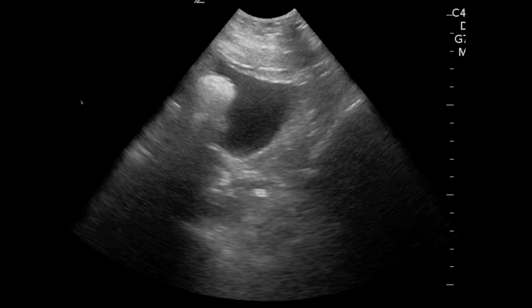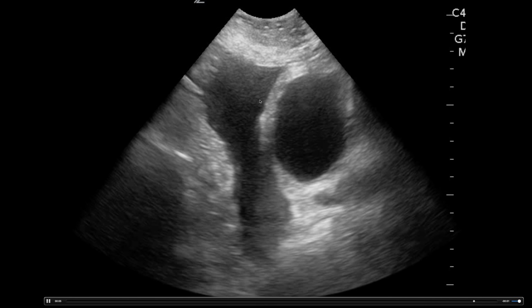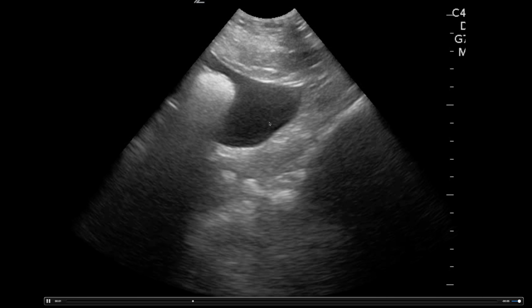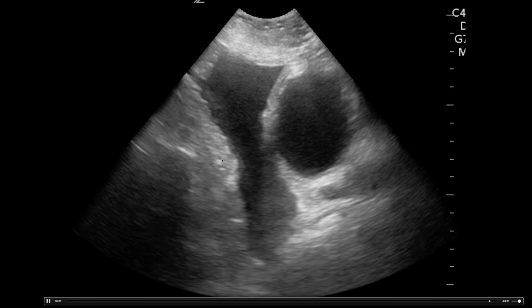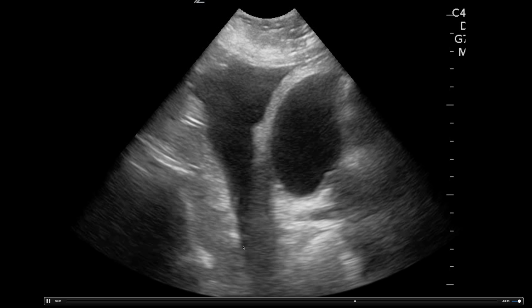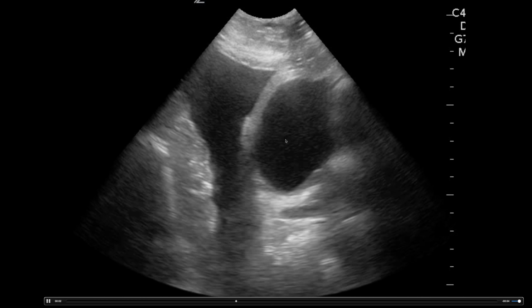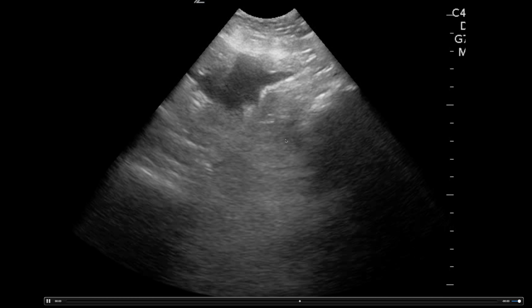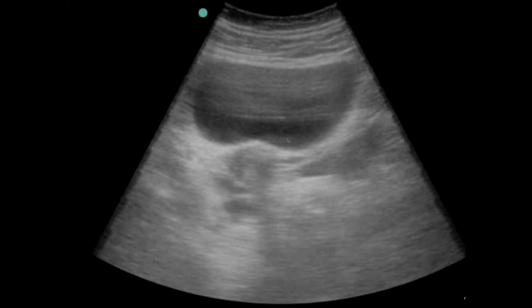How about some positives? So right off the bat, here's your bladder. Again, smooth contours. Notice the difference here. This is sharp. It dives into the crevices of the intestines, which is this stuff here on the left. It's irregular borders. It's diving all the way dependently in the belly and in the pelvis, right adjacent to the bladder. This is a long axis view of the bladder, so that's a positive FAST scan with a significant appearing amount of fluid.